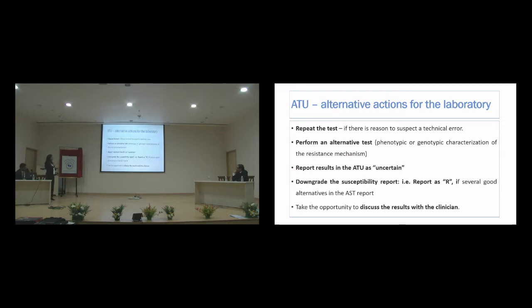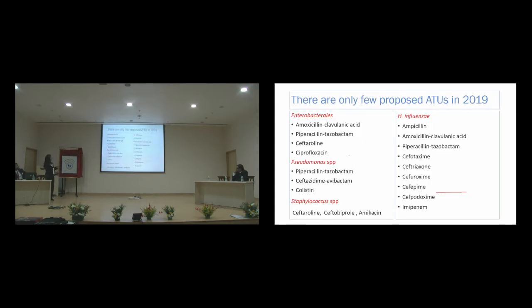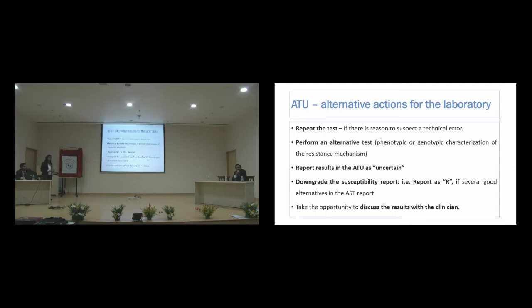Downgrade the susceptibility report. Report as R if several good alternative AST reports are available, and also discuss this particular issue with the clinician, because for you to repeat the test you need some time, right? So you discuss this issue with the clinician. For all these drugs they have described the term ATU. They have also told that this is a new concept they are bringing about. If this works out and gives a better clinical outcome, they are going to extend this for many other drug-bug combinations. So remember, ATU is actually something for the consumption of the microbiologist, not for the clinicians.